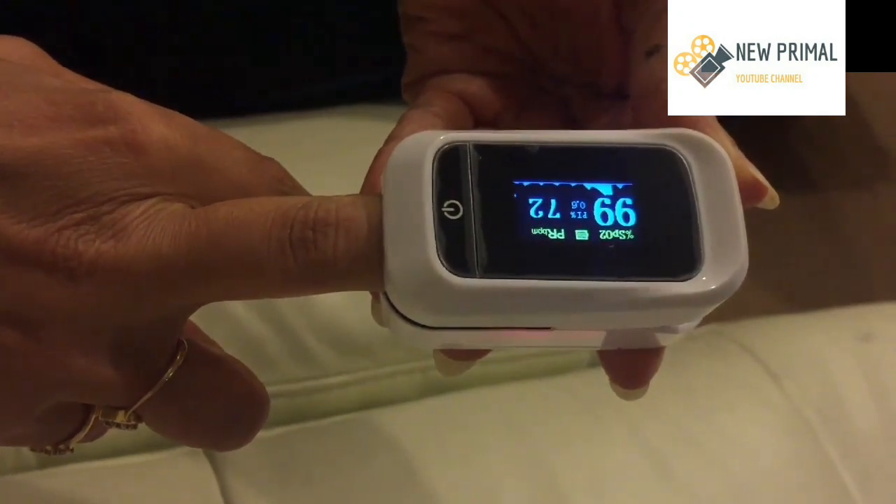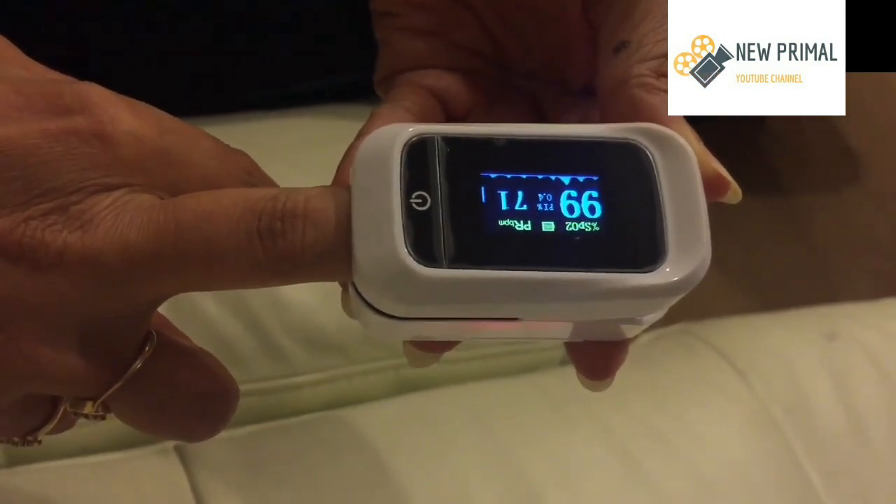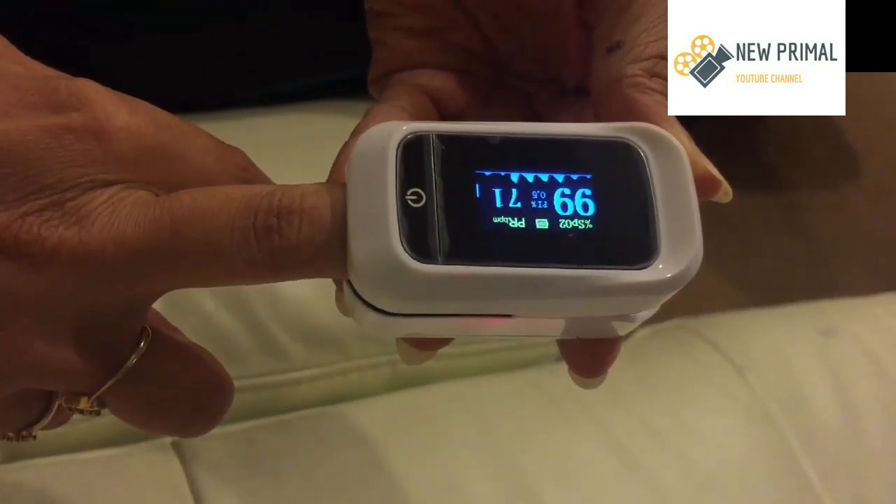And there is the oxygen saturation and the pulse rate. Simple as that.